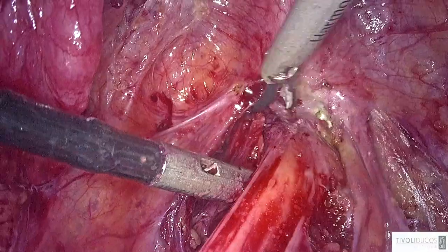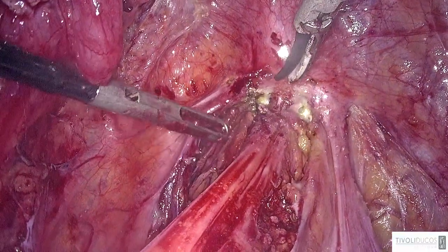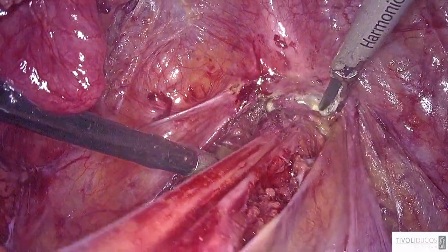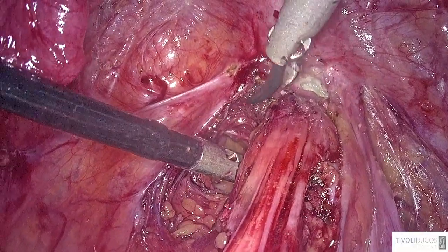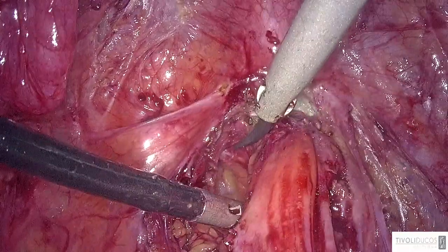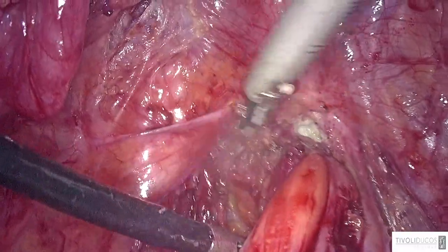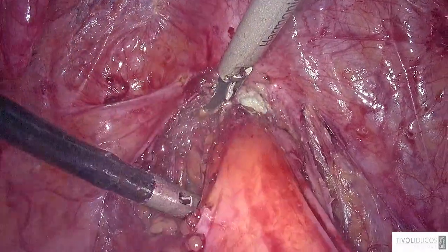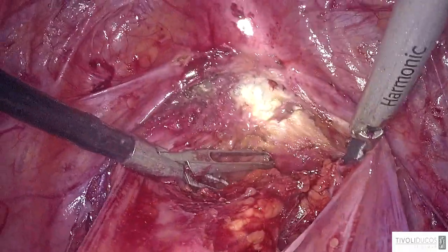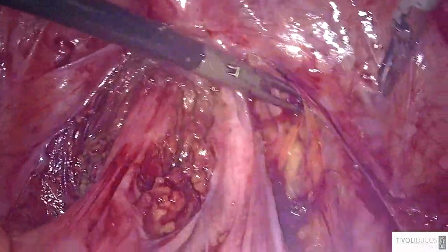Horace, we are discussing with Bülent, and now the question is, why don't you go with the sides that you open on the lateral side, on each, and you open first the lateral side to preserve the nerve, right? Yes. Okay. Yes, I want to preserve the nerve, so to release the rectum, I always go in contact with the rectum. And once the rectum is released, I will attack the parametrium. Because then the nerves are here.